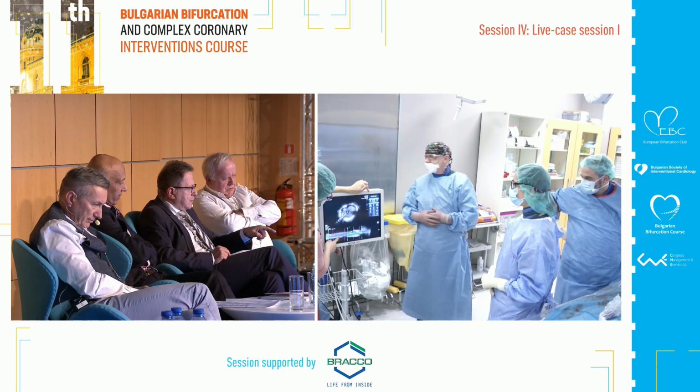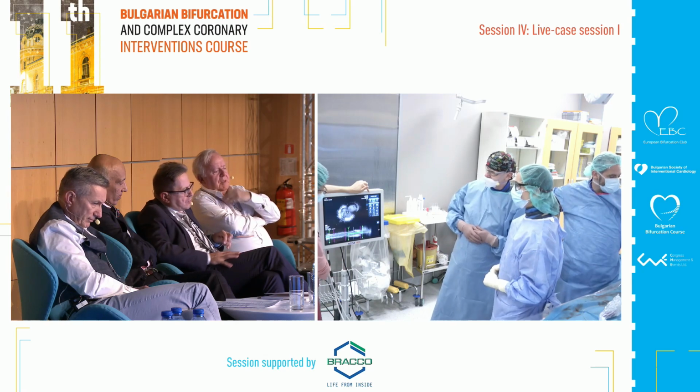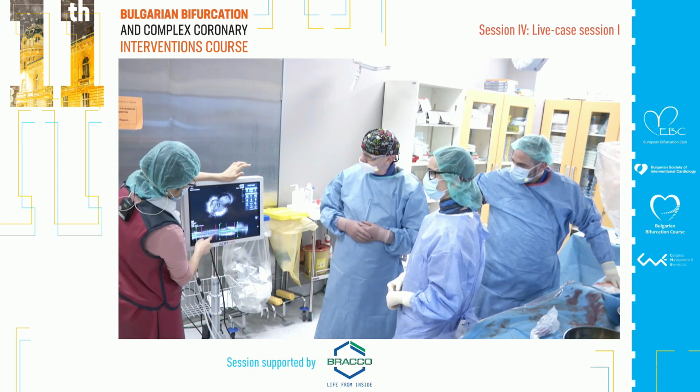Nice bone. Okay, now it's fine. That was just before the left ostium. The circumflex is fine, it's free of calcium. No calcium.